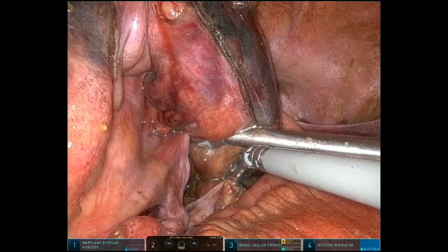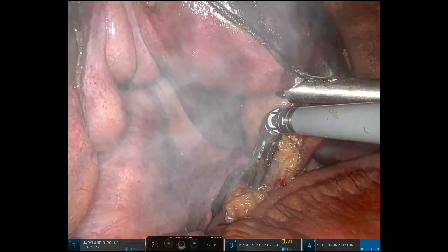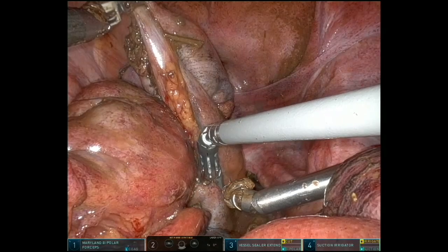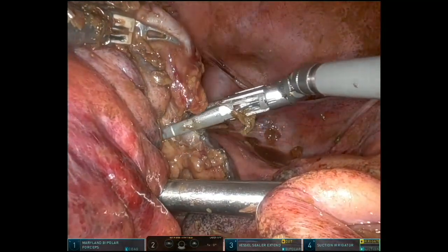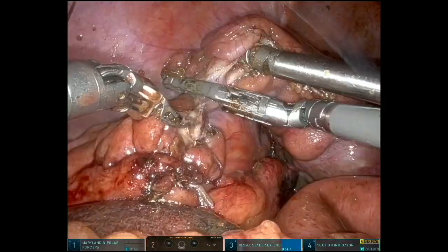We can see the area of perforation. Here we decided to divide distally and proximally for the natural orifice specimen extraction, also known as the NOSE procedure.